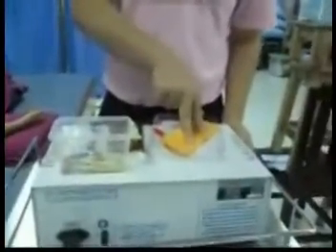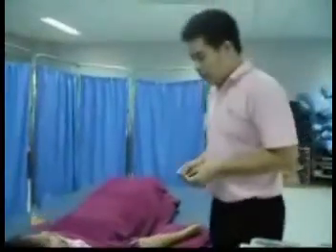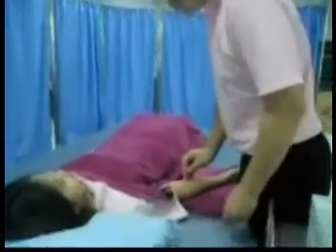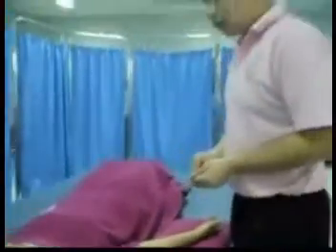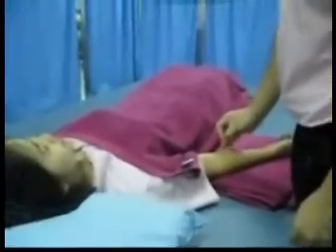After you set the parameters, you test the electrical current. Okay. And test the sensation. You remember this feeling, sharp and dull. Please close your eyes. Do you feel this area? Yes, sharp.